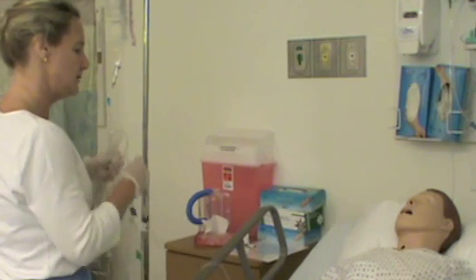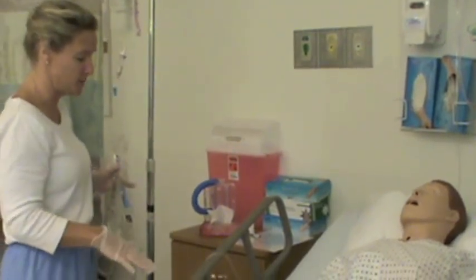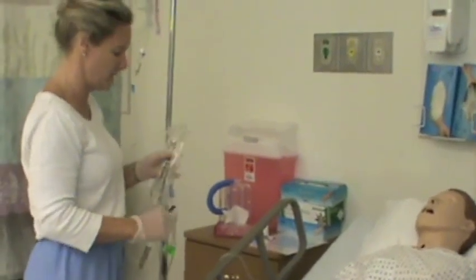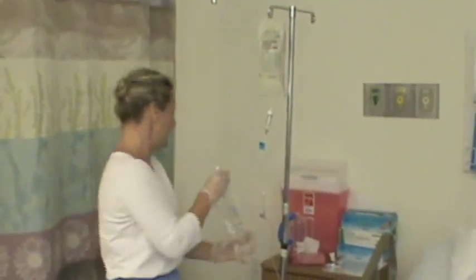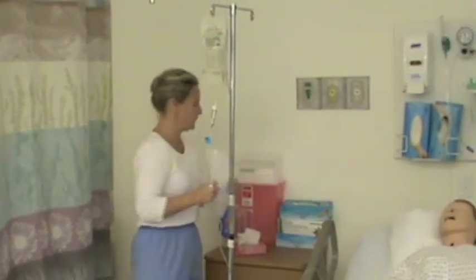The patient says he's good. I'm going to make sure the bed is in the lowest position, side rails are up, the patient is comfortable and has his call light in reach. I'll take my old equipment and dispose of it per hospital policy — tubing goes in the garbage, and if there is still solution remaining I'll drain it into the sink and then dispose of the bag. Then I'll wash my hands and document that I hung one liter of 0.9% sodium chloride at 125 mL per hour, 20 drops per minute, and that this is bag number two of three liters. Then I'll go back and check on Mr. Ito — physical assessment and IV insertion site — at a minimum of every two hours to ensure no infiltration, redness, infection, or inflammation.